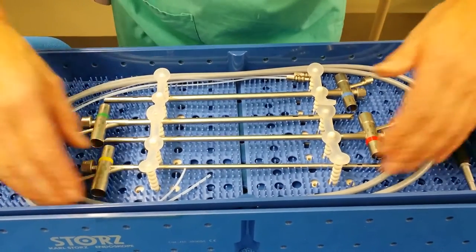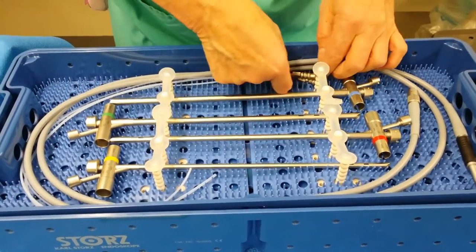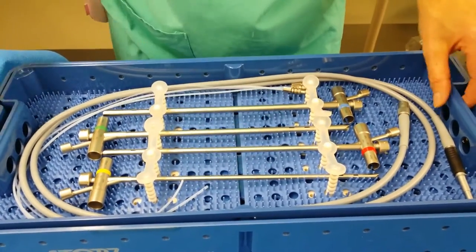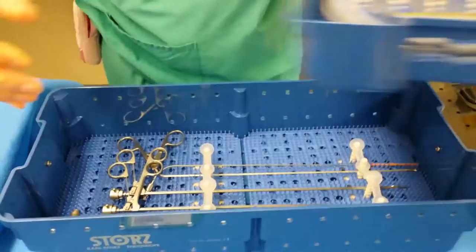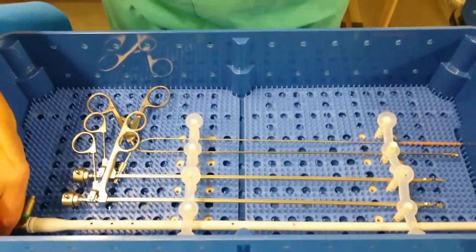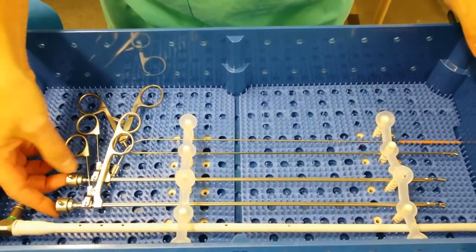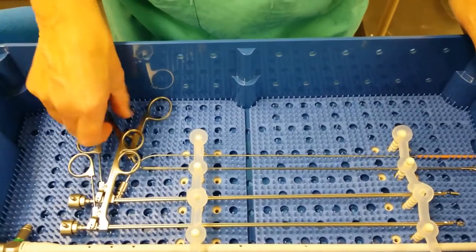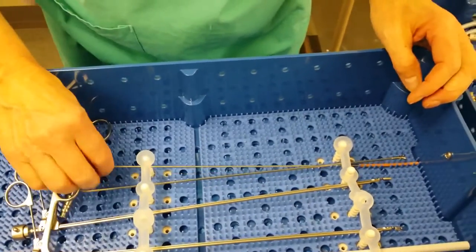A light lead on the top tray and three different sizes of suction cannulas. On the bottom tray, we've got a telescope, two optical forceps, a biopsy forceps, and a suction.